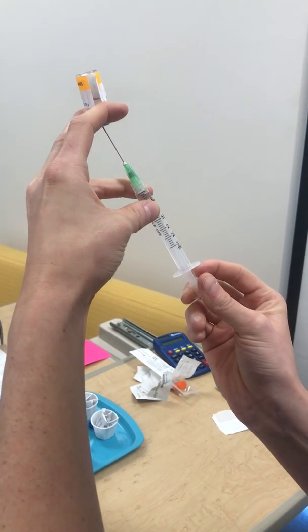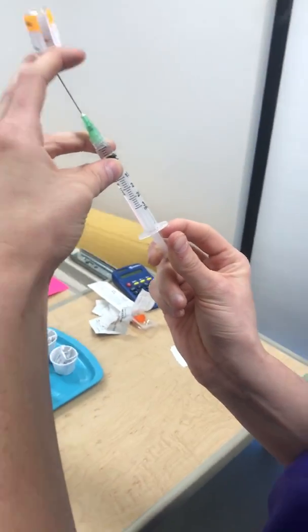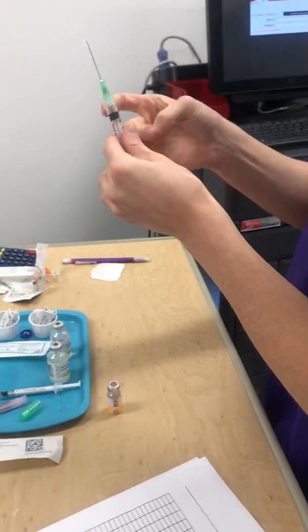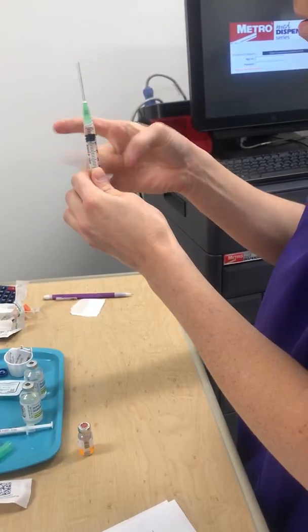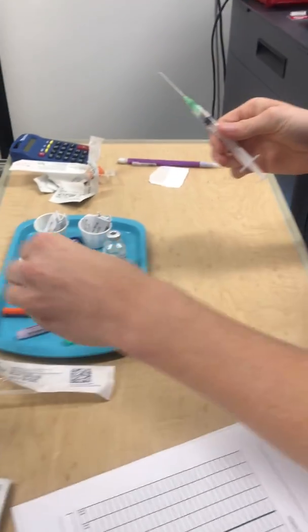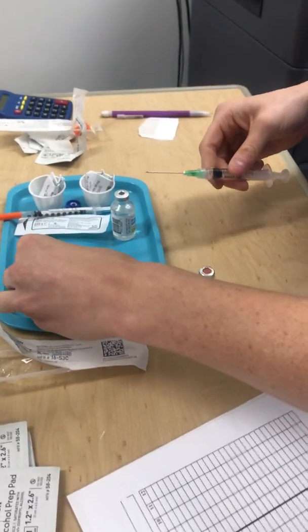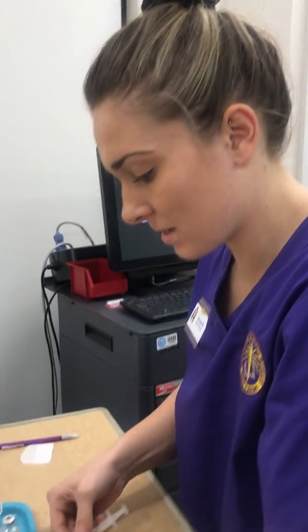I need a little more. So that's exactly what I need. Let's look back upside down, pull directly out, and then just want to get those bubbles out. Okay, and so now I'm going to use a hard surface to put this back on, and then I'm going to discard it immediately.